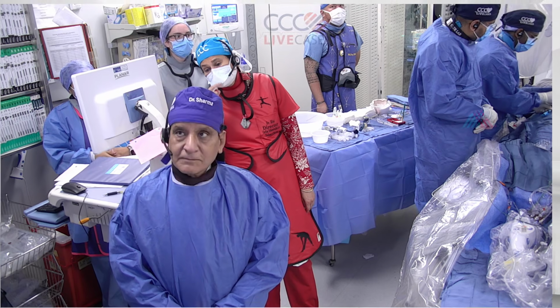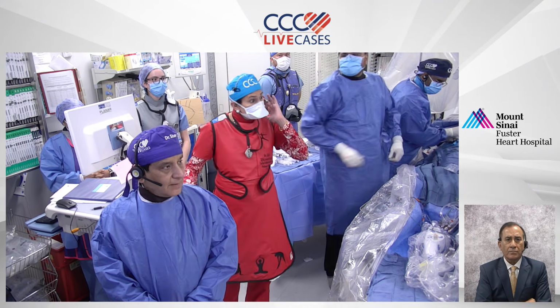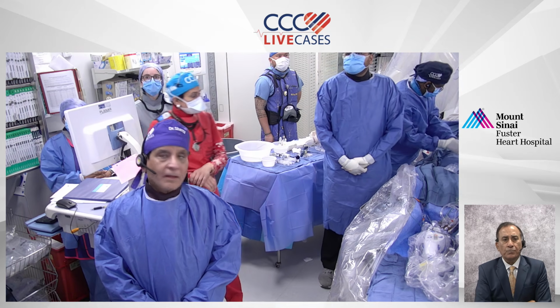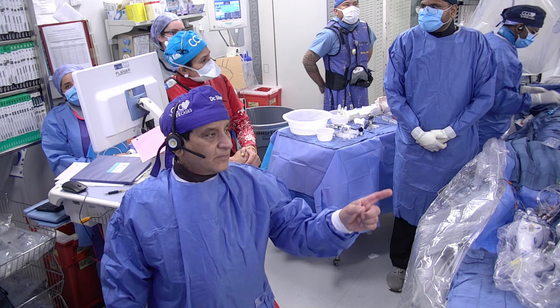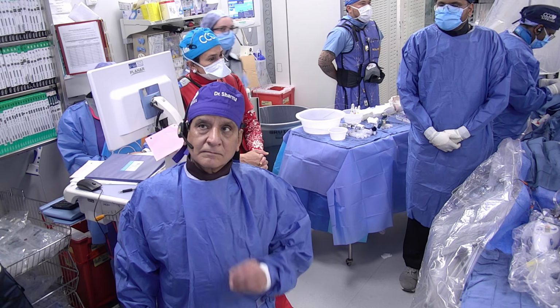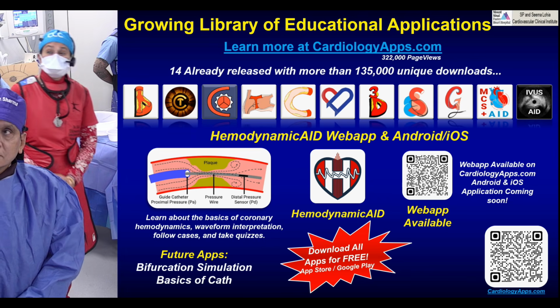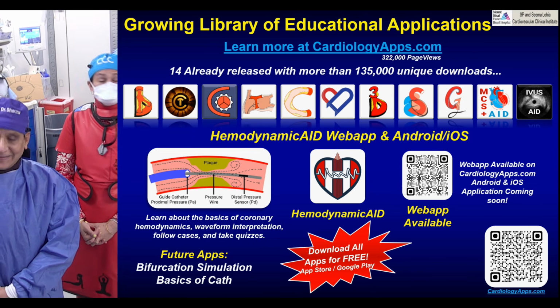Anu, final comments by you? No, I think, can I see? You can hear me? Yes, we can. Okay. I think our goal is teaching management of calcium and bifurcation. So we try to teach some new points that we have learned using atherectomy and IVL. And there is the educational app there.